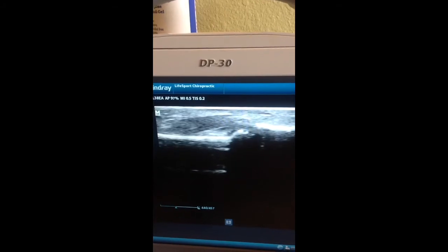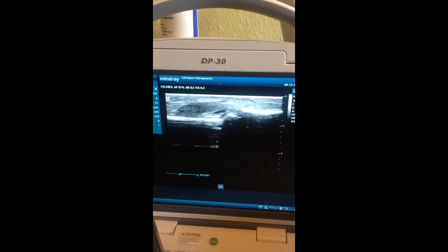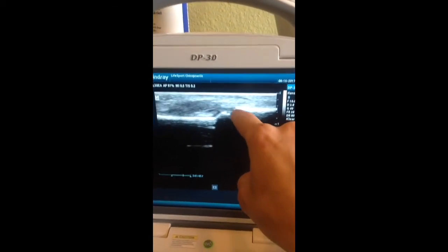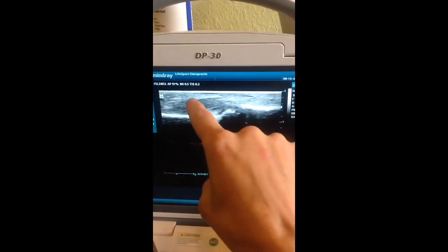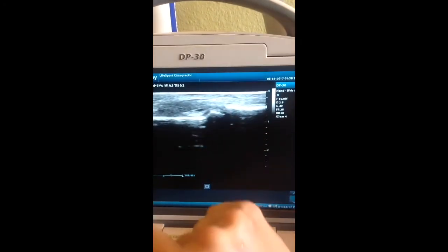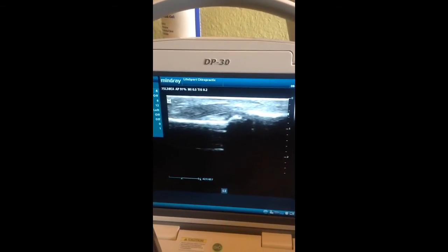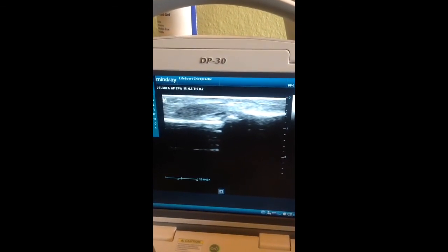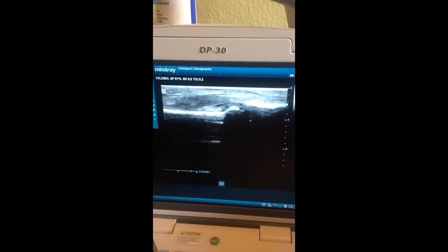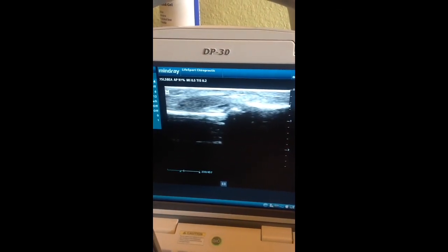This is very helpful diagnostically for what exactly is going on in these joints. This is why I love to use ultrasound for evaluating the finger — to see if it truly is coming from the joint, if it is truly coming from a flexor tendon, whether we see inflammation or material within the joint. That way we know exactly how to treat your injury, because if it is a pulley issue we change your climbing and technique one way, and if it is a flexor tendon issue we have to treat it in an entirely different way.